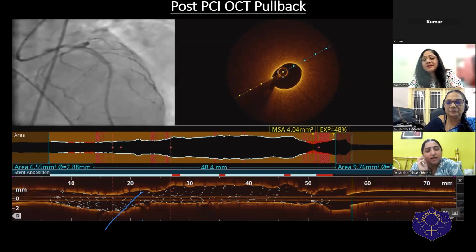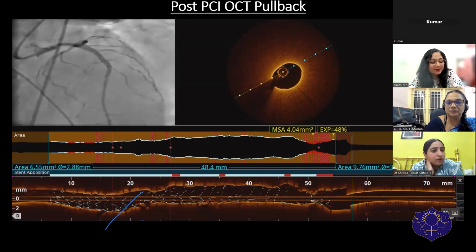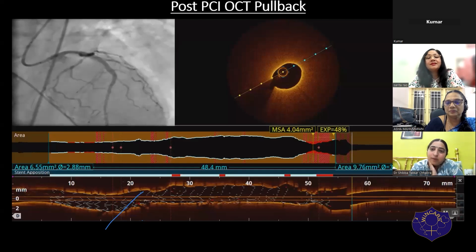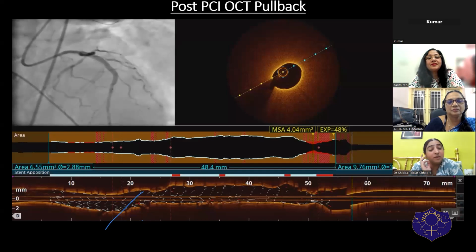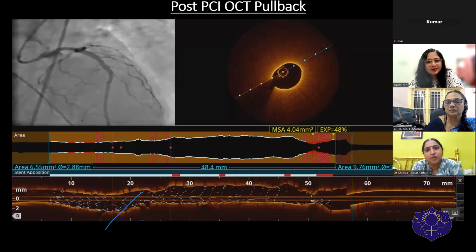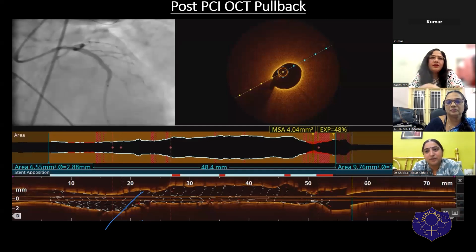Ma'am, two more things. Like initially also when we used an NC and we were ballooning, we were going across with OCT. With such a left dominant system, would you prefer to keep a wire right from the very beginning, not just after orbital atherectomy? And the second thing is, is upfront temporary pacing a must every time we go in for these procedures? Okay, two very good questions.